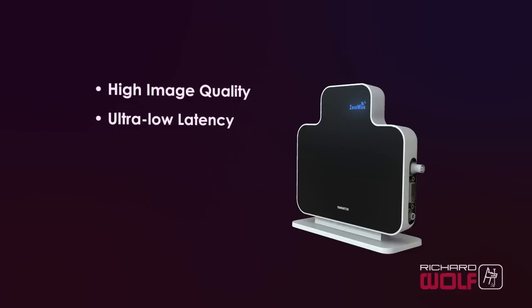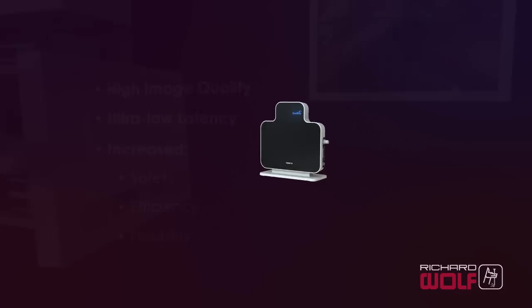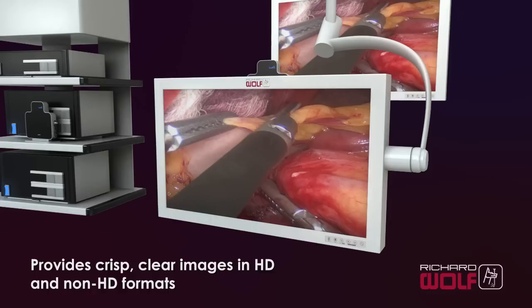ZeroWire provides ultra-low latency of less than one frame, and increased safety, efficiency, and flexibility. Tests in the surgical environment prove that ZeroWire provides crisp, clear images that are cable equivalent to human visual perception in HD and non-HD formats.